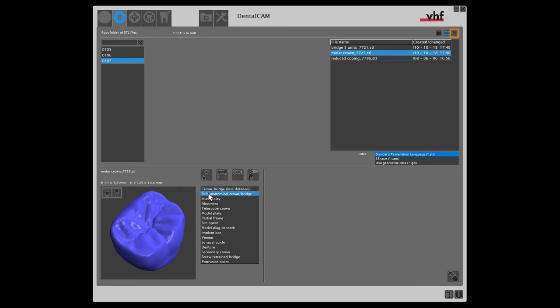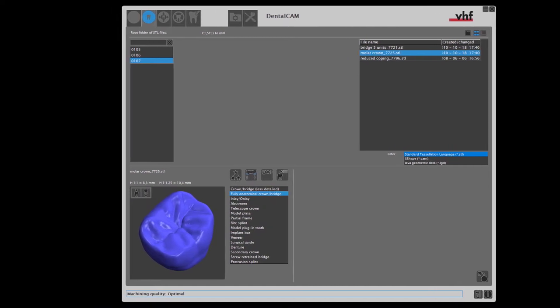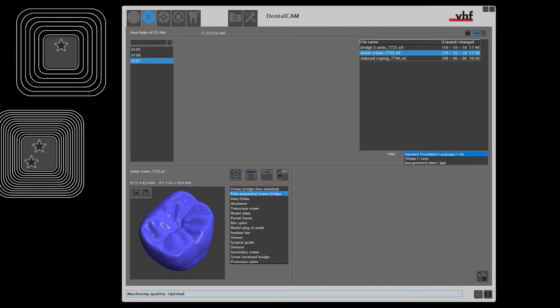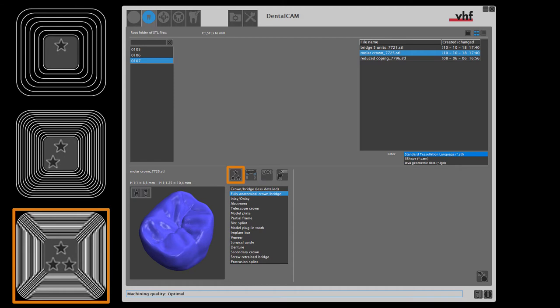Now we choose the processing quality for the selected STL. A high processing quality is achieved by smaller path distances when finishing outer surfaces. Smaller path distances lead to smoother surfaces, but also to an increased processing time.